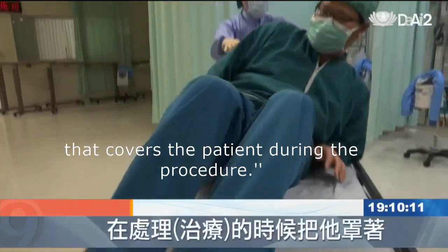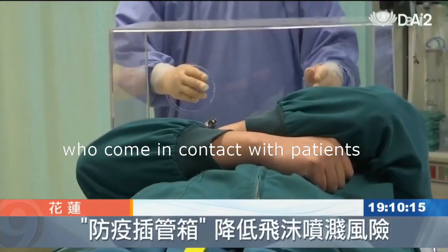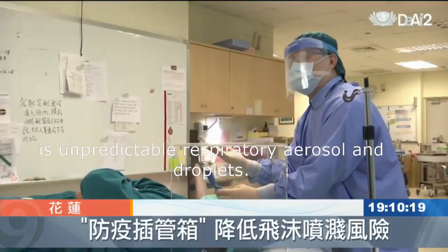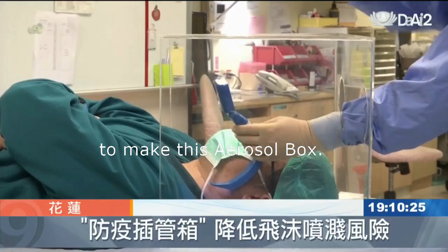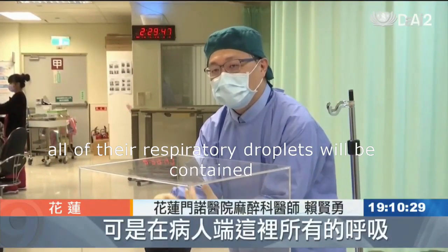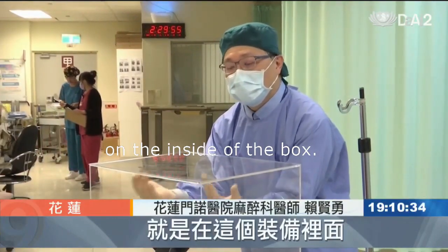It's an acrylic protective cover that covers the patient during the procedure. The biggest concern of frontline medical staff who come in contact with patients during intubation is unpredictable respiratory aerosol and droplets. Dr. Shen Yang Lai of Hualien Mennonite Christian Hospital was inspired by infant incubators to make this aerosol box. We can insert both arms, but on the patient's end, all of their respiratory droplets will be contained on the inside of the box.